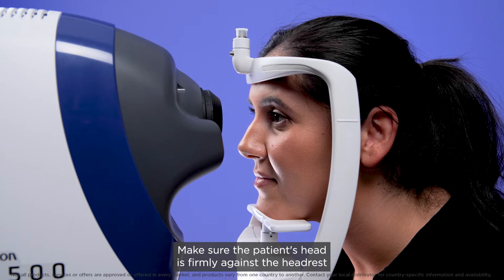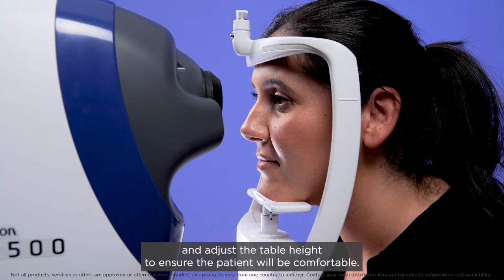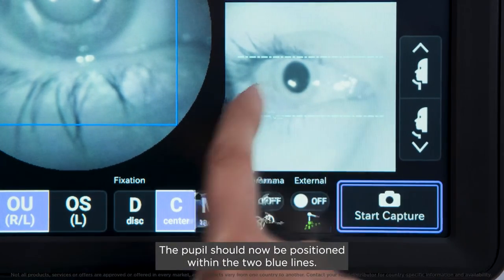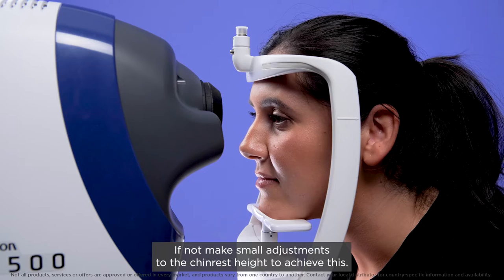Make sure the patient's head is firmly against the head rest and adjust the table height to ensure the patient will be comfortable. The pupil should now be positioned within the two blue lines. If not, make small adjustments to the chin rest height to achieve this.